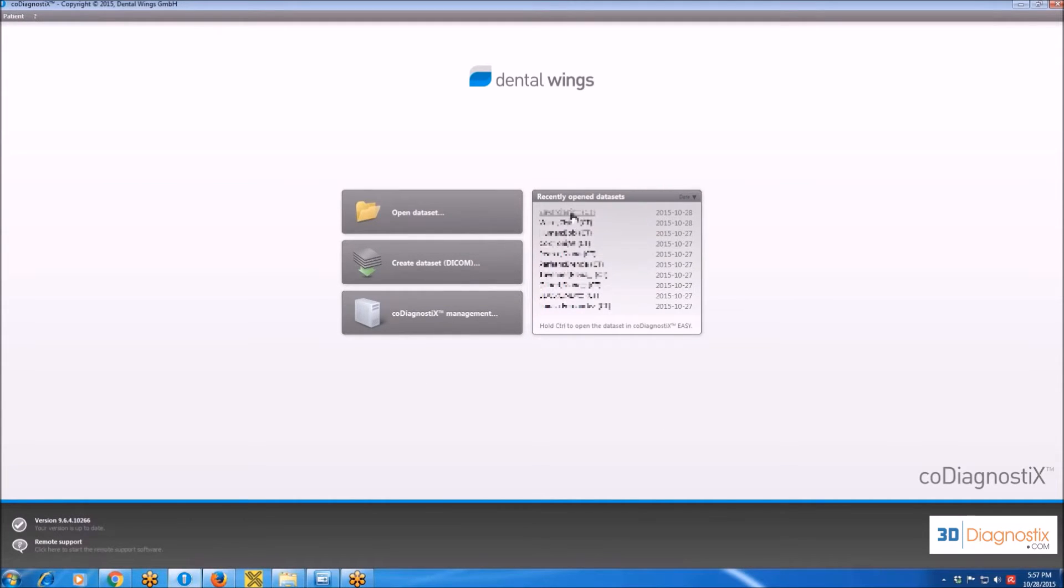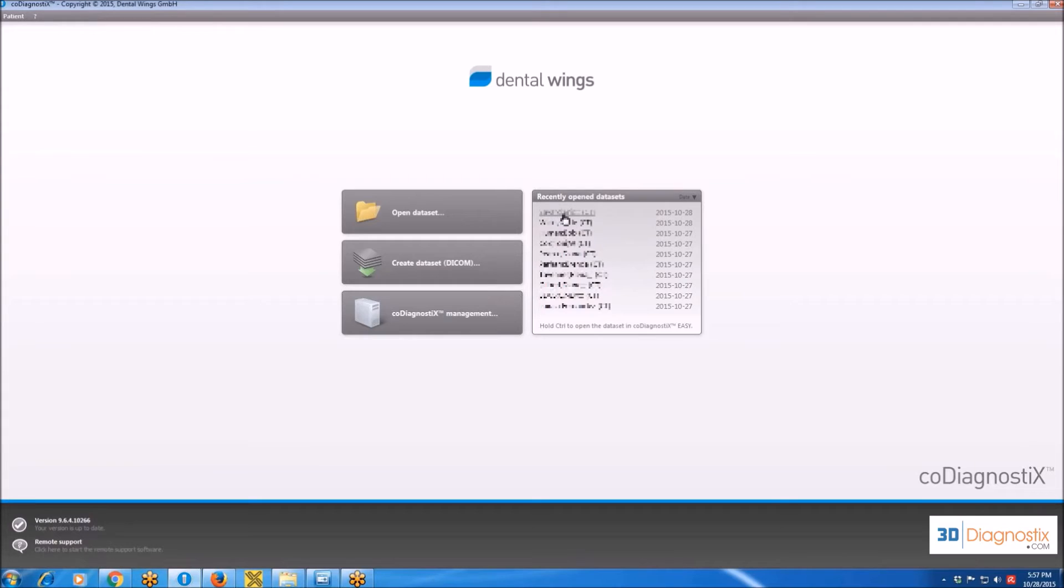Once the data is created, you'll find it in the window on the right over here, and you'll find the patient's name. If I click on this patient, I am going to open the dataset.